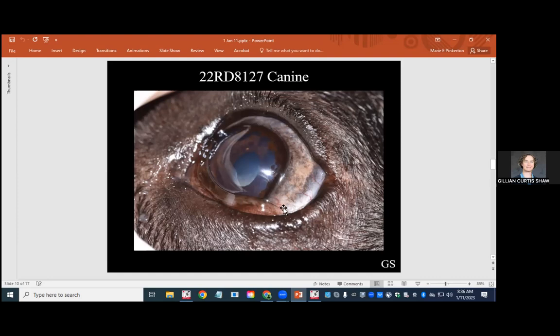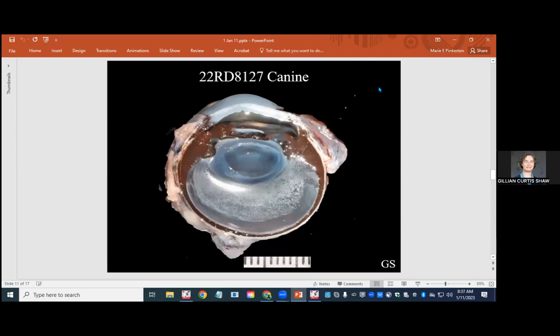So we got the globe, and because of the nice clinical history, we took a picture because otherwise it's not that remarkable. But here's the globe hemisected. So right off the bat, you can hopefully appreciate that the iris, ciliary body, and choroid are all quite thick and solidly brown. And then when you look around, there's maybe a little bit of speckling pigment out here in the subconjunctival tissue slash episclera. And then the sclera itself is maybe not as crisply white as we would normally appreciate in most normal globes. Especially over here, you can see the sclera there is quite speckly and brown.